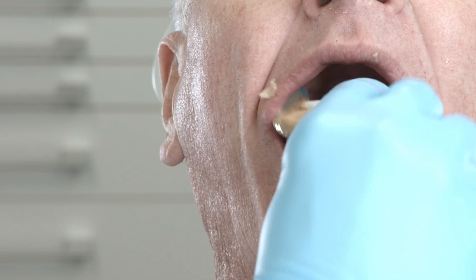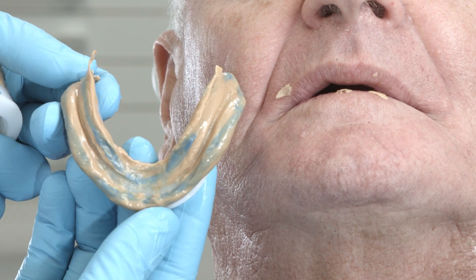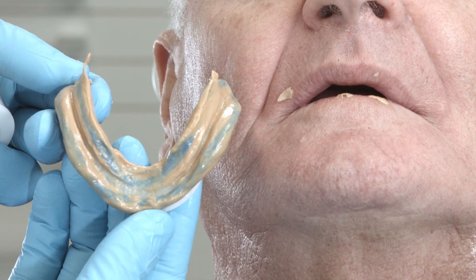The process is always the same — for the shaping of the functional margin, the wash impression, and any necessary adjustments with Virtual Extra Light Body, for example. Remove any excess in the area of the retromolar pads in particular. This will ensure smooth movements at a later stage.